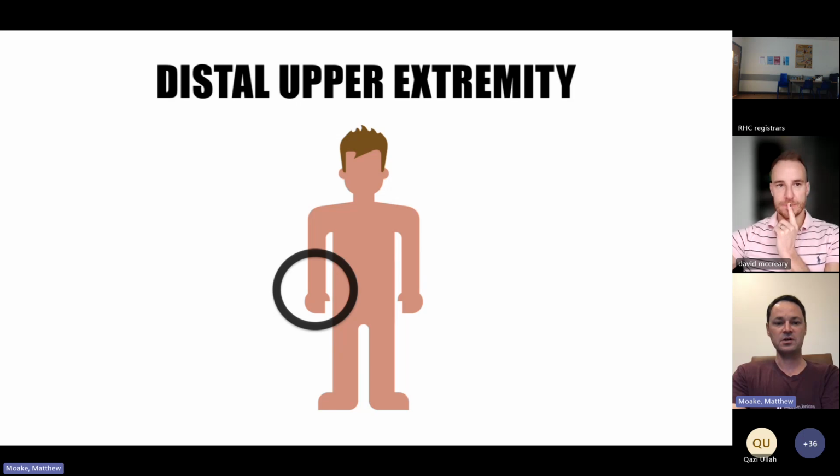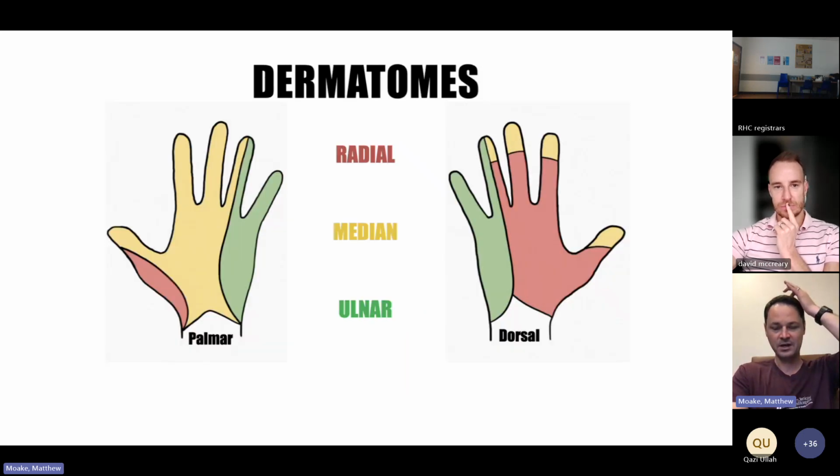So for the start of this, we're just going to do distal upper extremity. This is a great place to start. They're very straightforward, really low risk. There's no major injury you're going to do. There's no organs. You're not going to give somebody a pneumo by hitting someone in the chest. So it's a great place to start, and there are lots of indications for them.